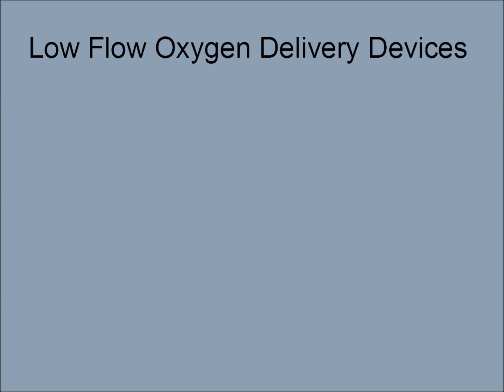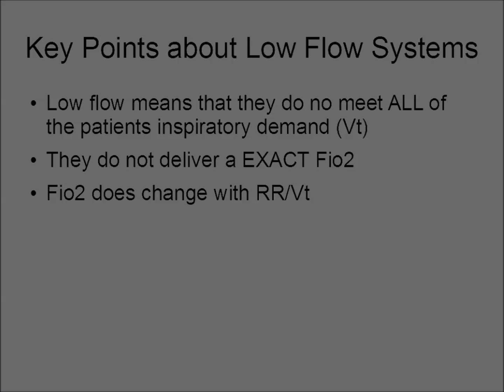Alright, so in this video I'm going to discuss low flow oxygen delivery devices, some information about low flow devices, and then the actual devices themselves and how each one of them works. Some key points about low flow devices is that low flow means that it will not meet all of the patient's inspiratory demand or tidal volume.